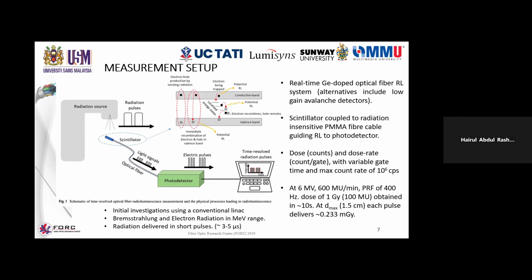And this light intensity is directly proportionate to the dose being delivered or absorbed by the scintillator, through the mechanism of radioluminescence, which is essentially an electron-hole pair being produced by the ionizing radiation.